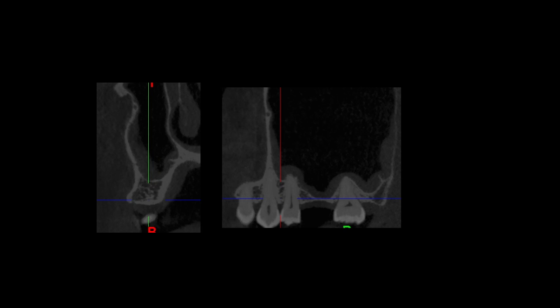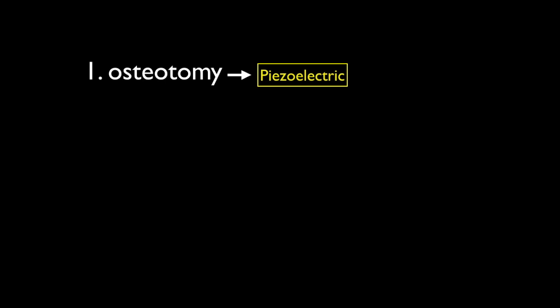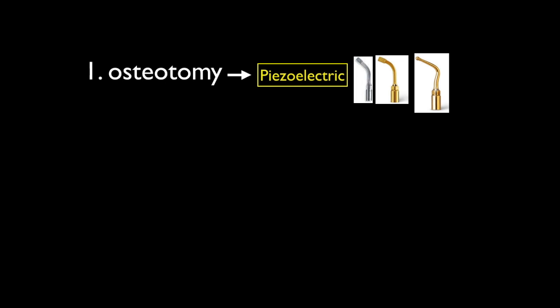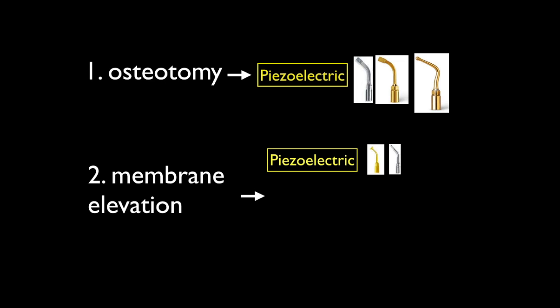So we do not expect any particular anatomic difficulties in this case. Our plan is to continue with osteotomy using piezoelectric cutting tips — in the beginning we will use the straight diamond-coated cutting tips to generate the initial shape of our window, which we will finalize afterwards with a round-shaped diamond tip. Once the window has been detached and mobilized, we will continue with initial membrane elevation using the piezoelectric tips and then finalize the elevation with hand instruments.